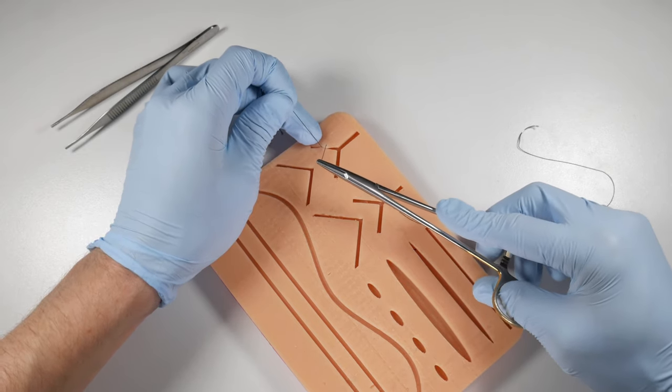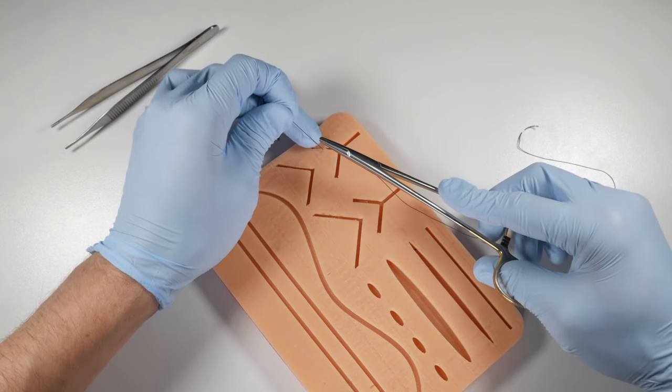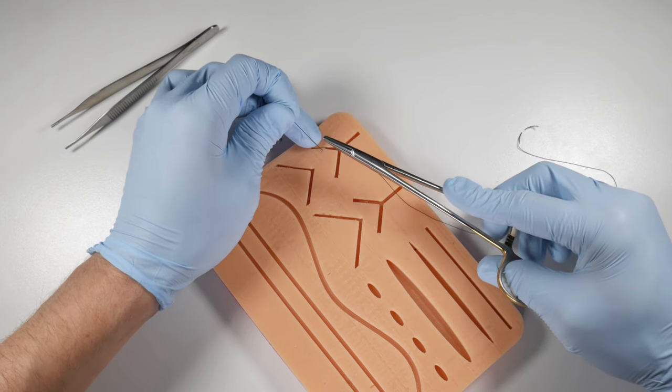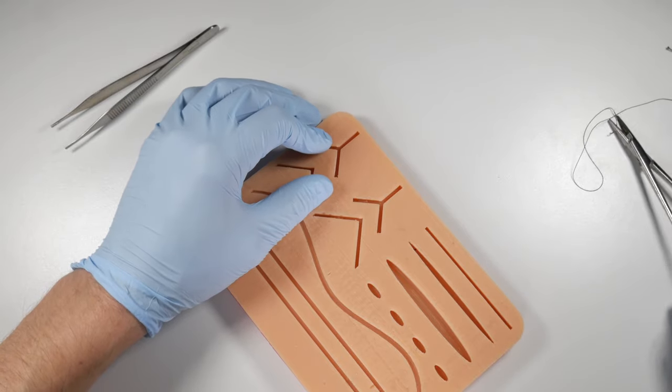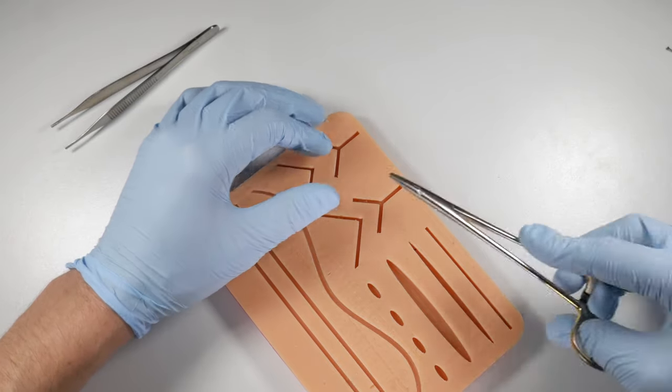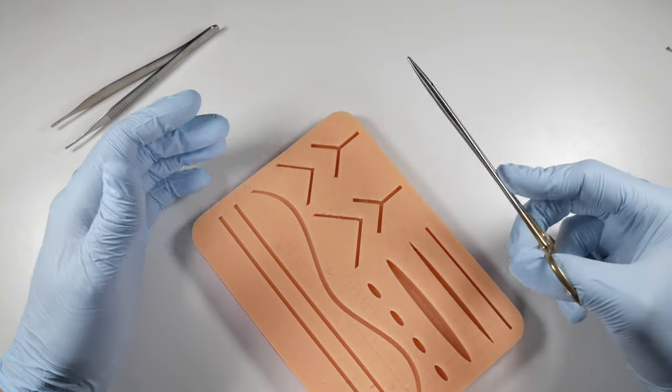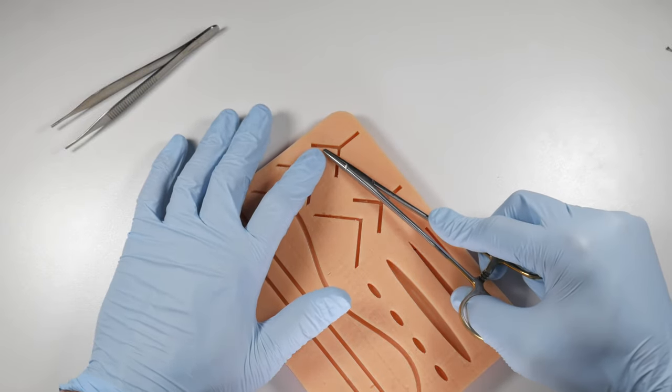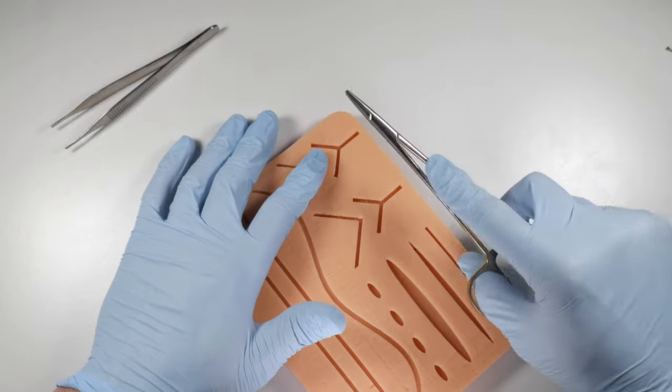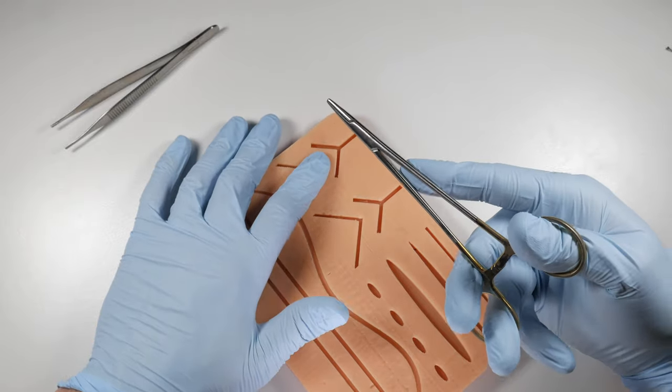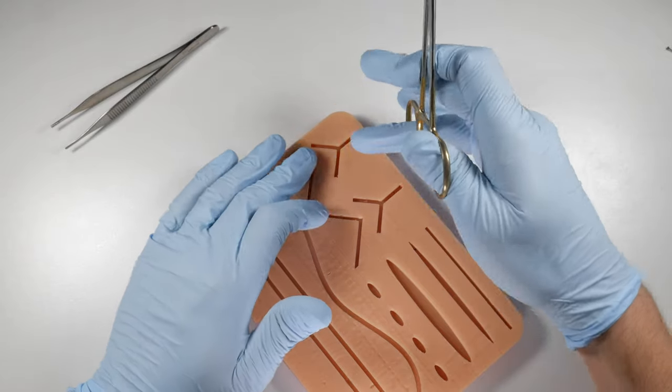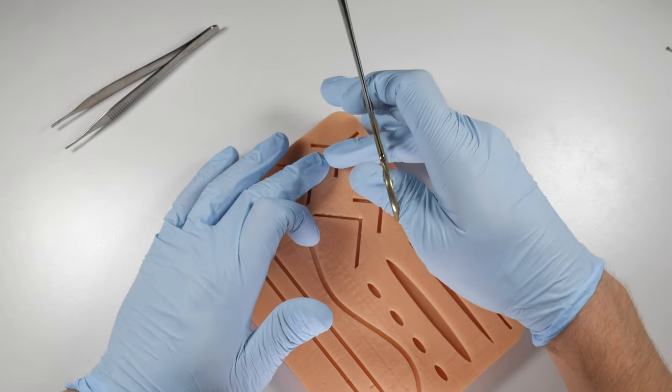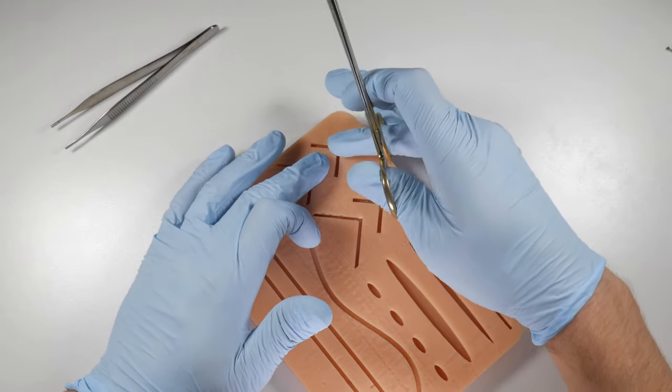As this starts to heal and that tissue begins to retract a little bit, it's going to lay down flatter. Now in the mouth, scarring is not a huge deal, but there are areas that are in the aesthetic zone where if you can avoid suturing in those areas, you want to make sure that you're doing it properly by everting those edges, which means entering at a 90 degree perpendicular angle to the tissues, and everting those edges slightly by taking the nice appropriately sized bites of two to three millimeters from your incision line.